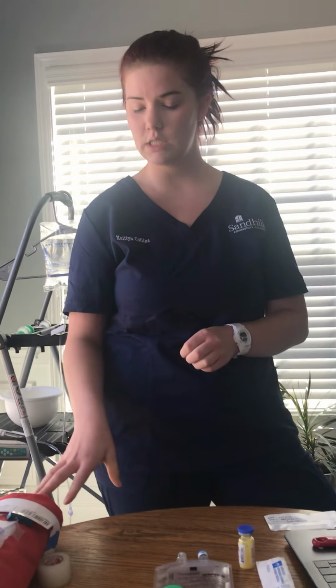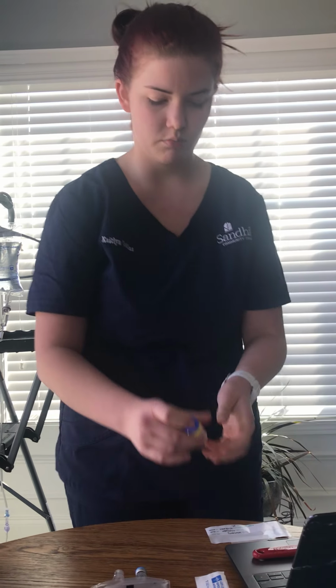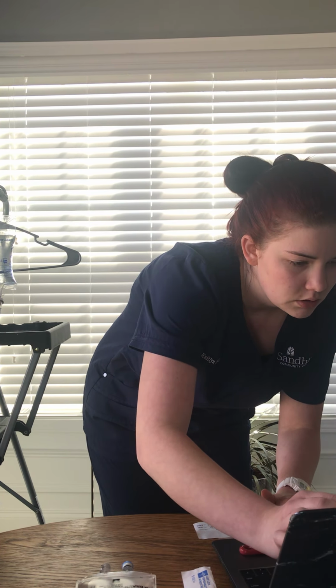Can you just one more time state your name and date of birth for me? 214XX. Thank you. And do you have any allergies? No? And that matches. So I'm going to be doing my first check. We've got the cefazolin, 1 gram. Cefazolin, okay.